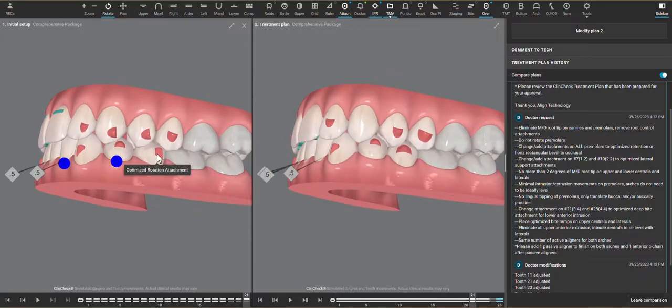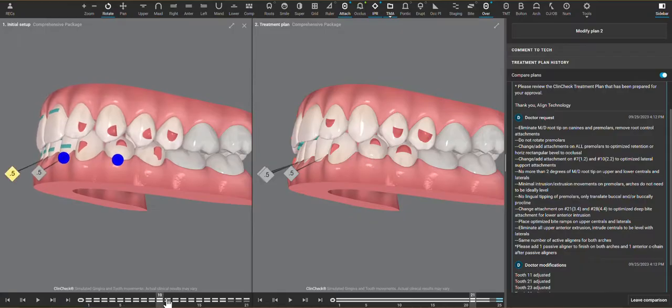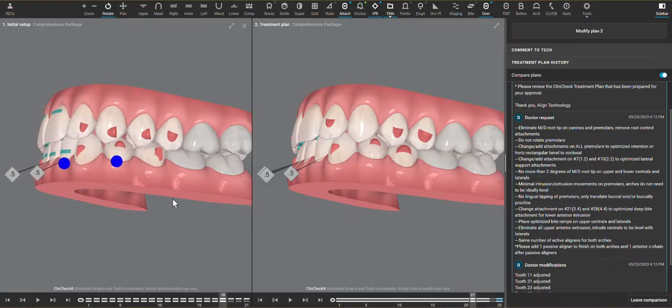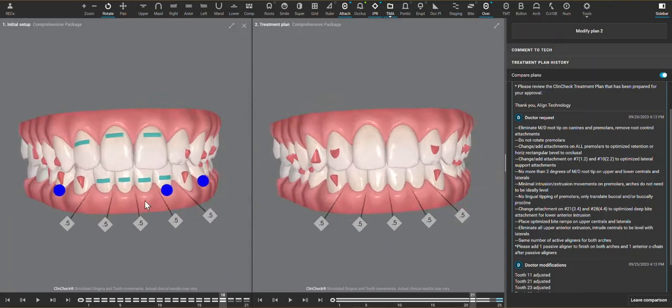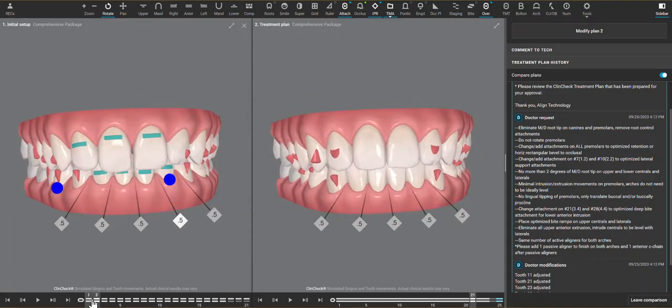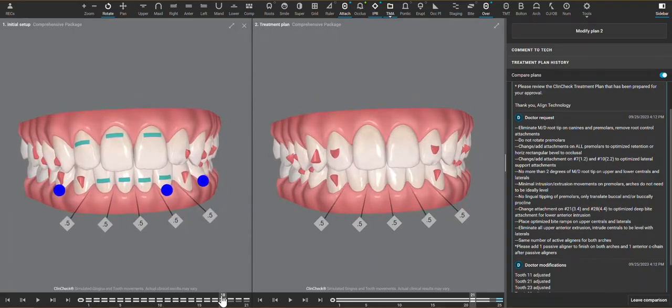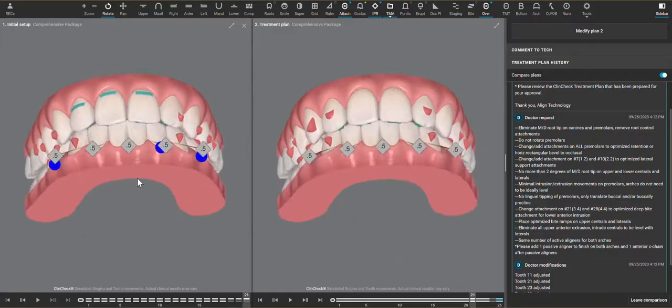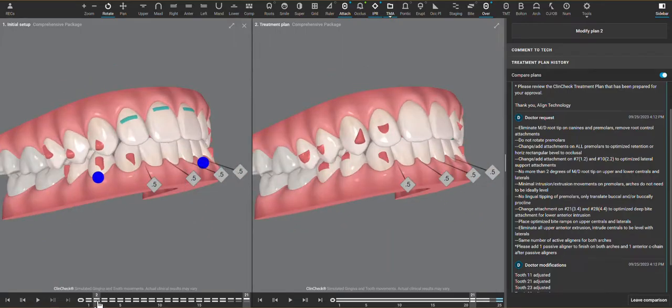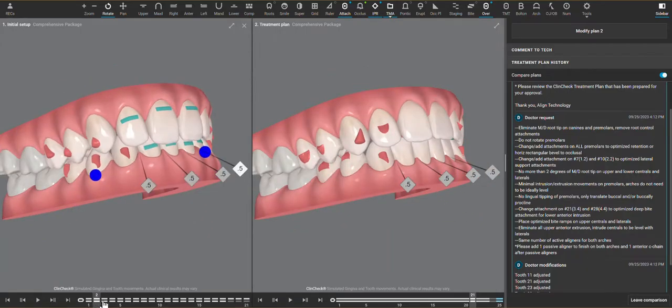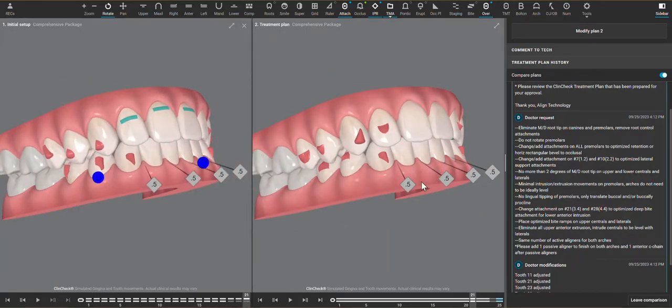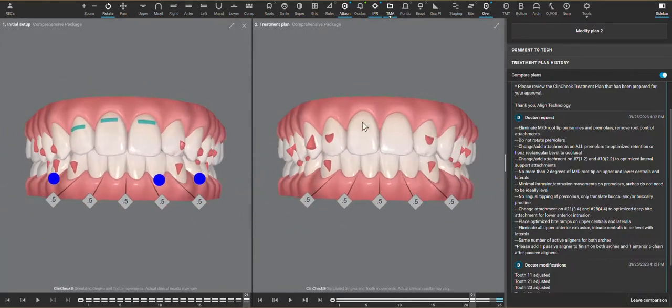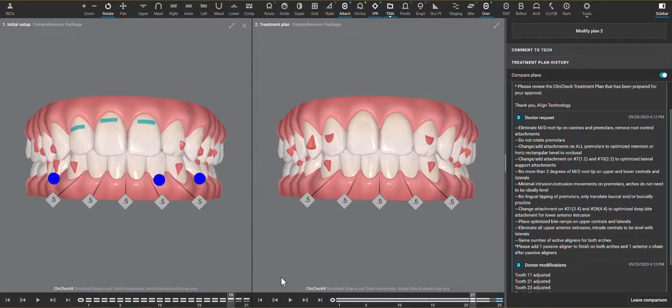Also, if we are doing more rotations of the premolars, then those are other movements that are trying to happen in the posterior when really the patient is just looking for a better solution for the deep bite that's causing traumatic occlusion, chipping and wearing the teeth, and just closing this upper diastema.